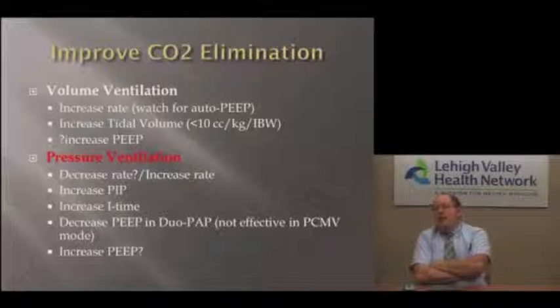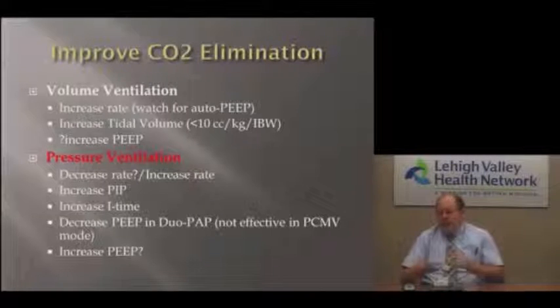And again, increased PEEP, just like I had above there, may work, may not work, depending upon the patient population. Sometimes it does. You increase the surface area of the lung, you recruit more alveoli because you pop open closed atelectatic alveoli with the PEEP, and thus you get more CO2 elimination. But I can't tell you for sure that's going to work. You really have to assess the patient and see where the patient's trending. You can look at volumetric CO2, you can look at your end-tidal CO2 to help you out also in those situations.